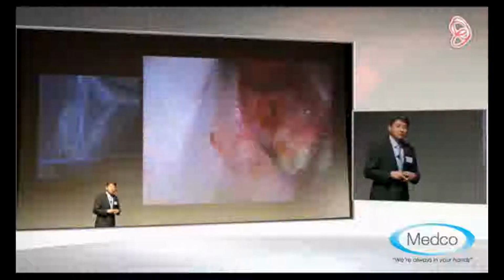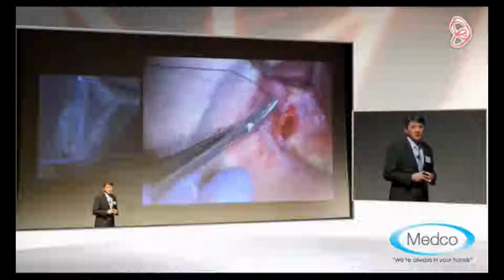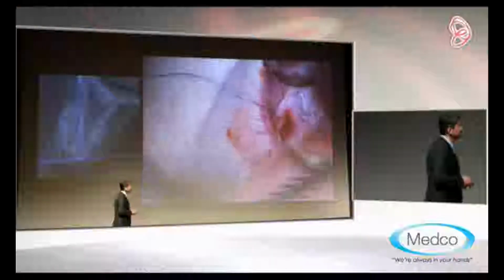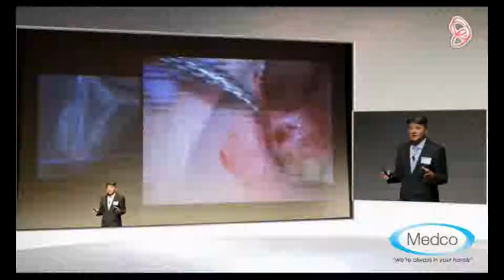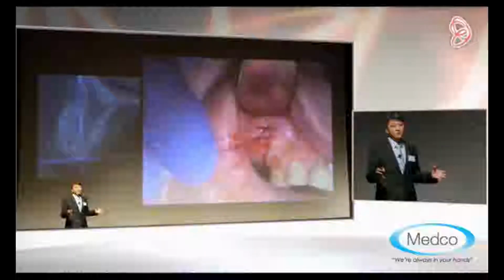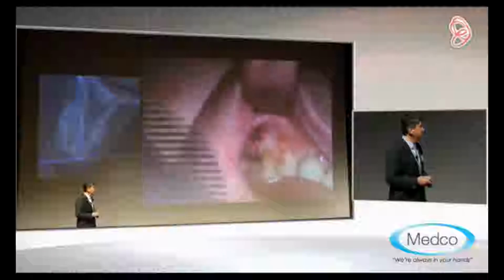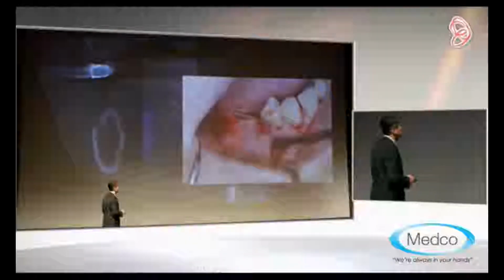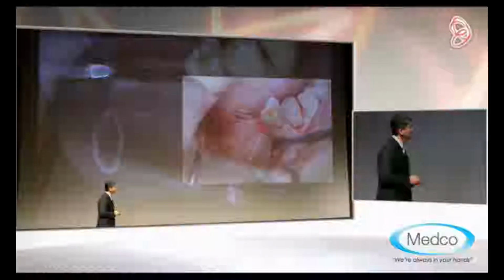And then we will massage the patient to eliminate the dead space, to prevent any infection, and just simple suturing technique is done. So very simple procedure, and the bone grafting surgery has reduced from 2 to 3 hours to just 15-minute procedure. So I truly believe that this is the best technique out there. It works really well for the mandibular as well.